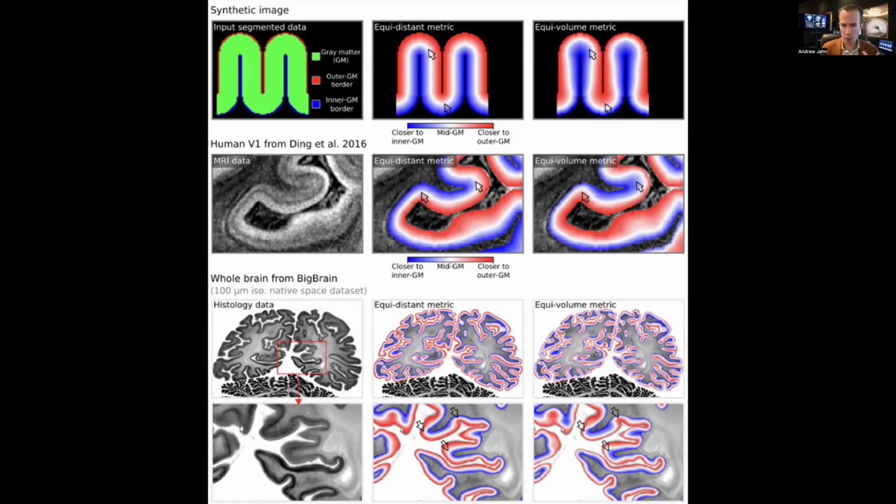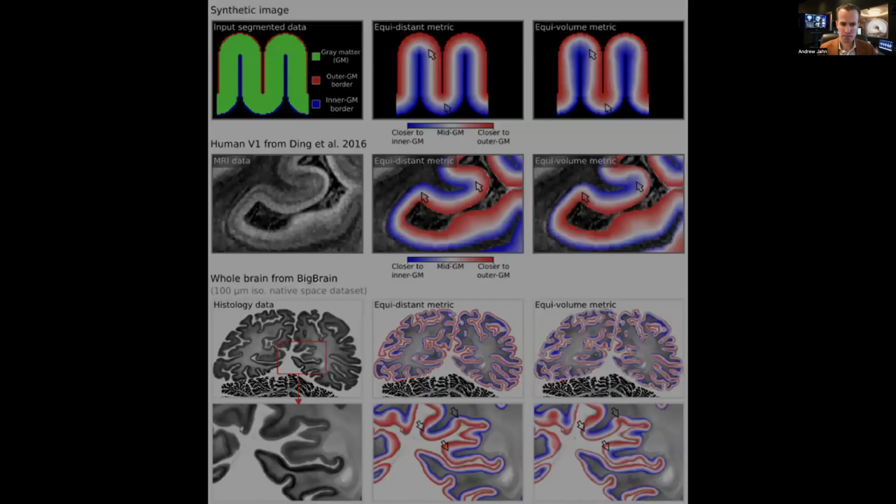Equidistance and equivolume don't always track perfectly. You can see these arrows, there's some difference between them. Equidistance tends to be relatively stable across the entire ribbon. Equivolume can have much greater changes. And when you start to create as many layers as you want, again, remember that both of these principles are going to try to be adhered to by their software.